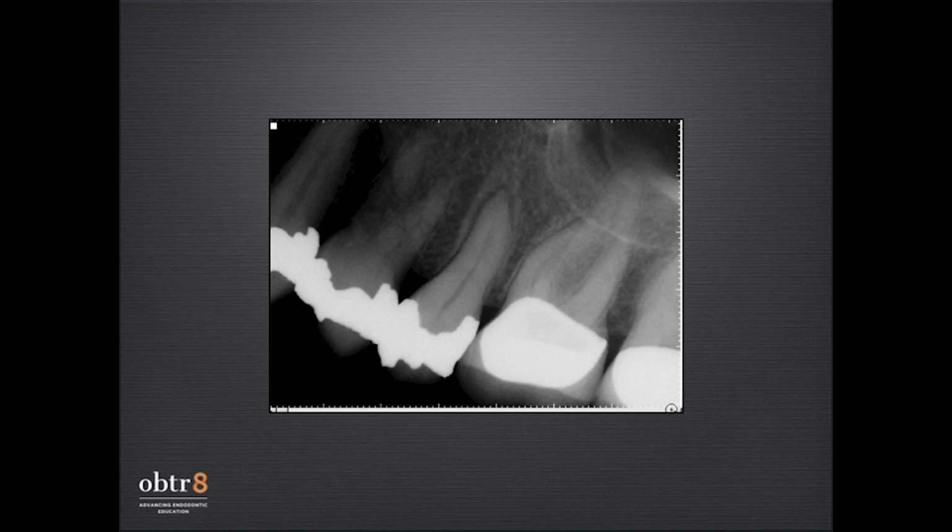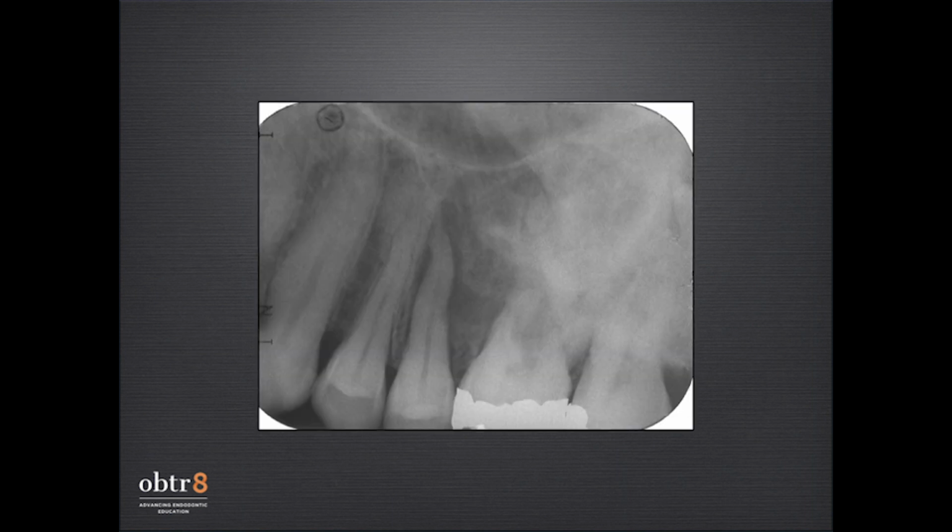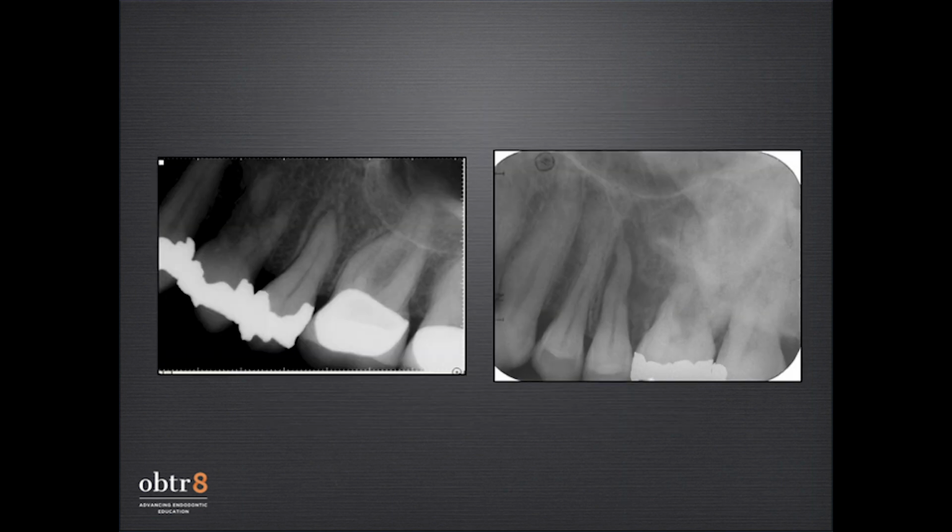And the testing in this case, again, doesn't lead to much uncertainty. It's very responsive with a linger to cold, and on access, there's an extremely inflamed dental pulp. Continuing with the theme of before, however, here we see a relatively unrestored tooth number 13 with another symmetrical widening of the ligament space. And as we look at those two images side by side, we see the irreversible pulpitis on the left and another example of osteosarcoma on the right.